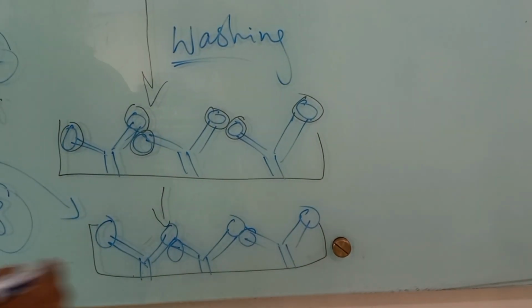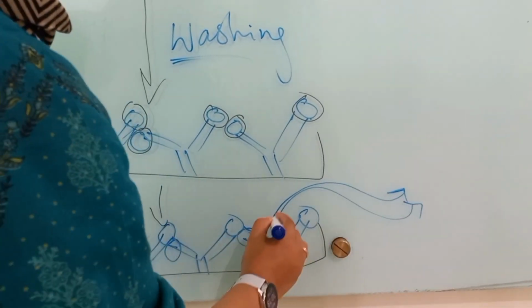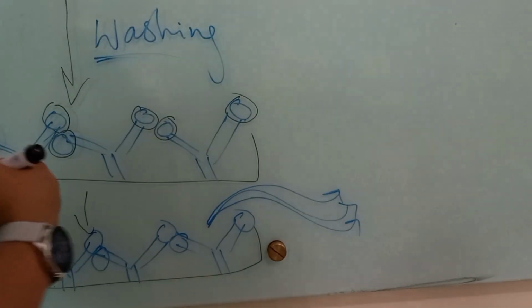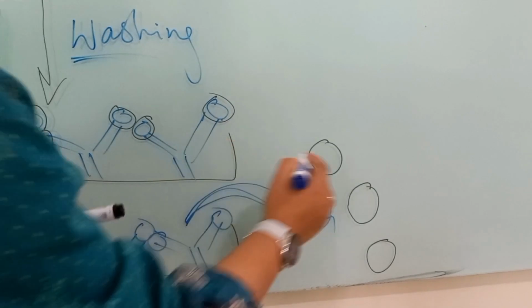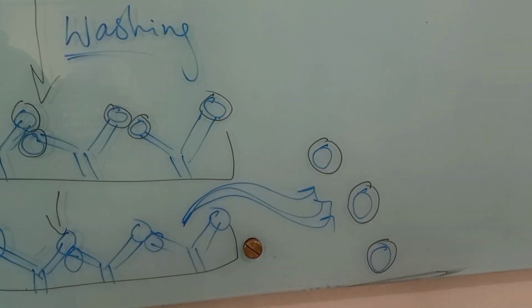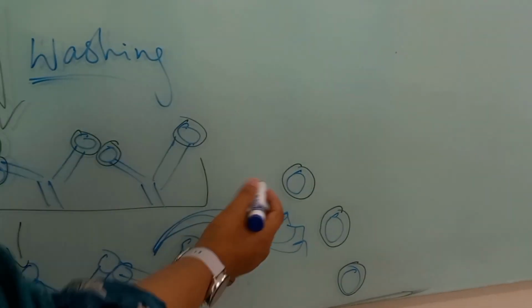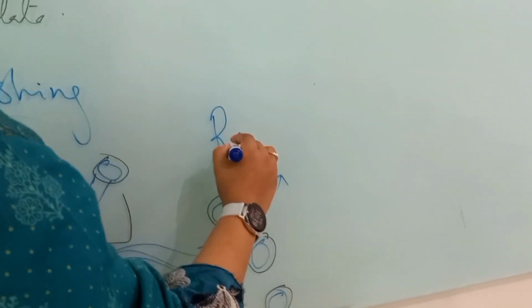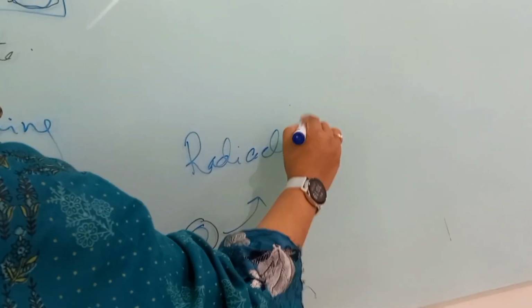And now as a result, what will be released here? The hot antigens. Hot antigens are released. Why? Because the cold antigens have replaced them, as they were more competitive to bind with these antibodies. Because these are radioactive, when they are released there will be a release of radioactivity.